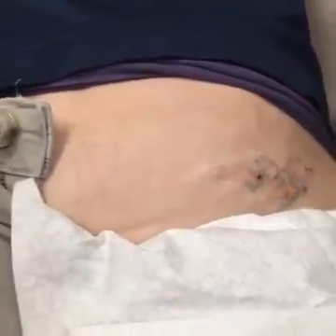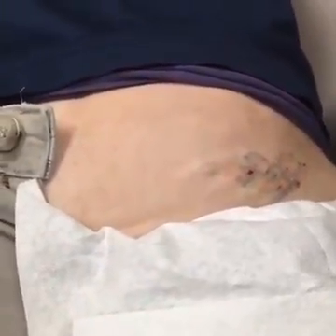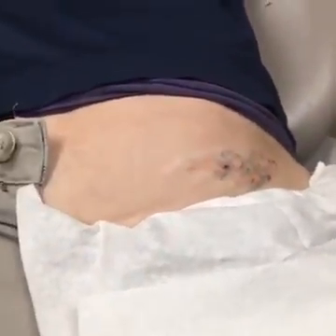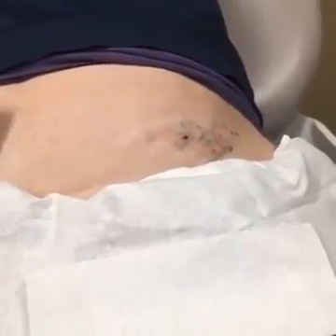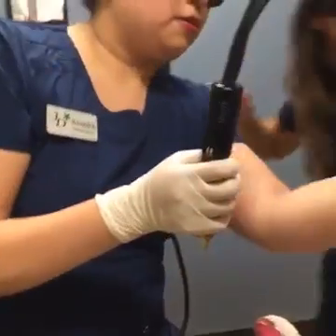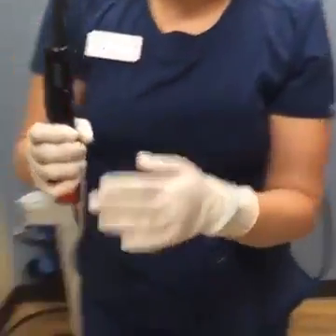The total time of treatment is actually shorter than how long it just took us to numb that up. And so, you guys will notice the actual laser treatment is very quick. There's really no downtime, so we'll laser her and she will be back off to work. So Bridget is handing Alondra the handpiece.